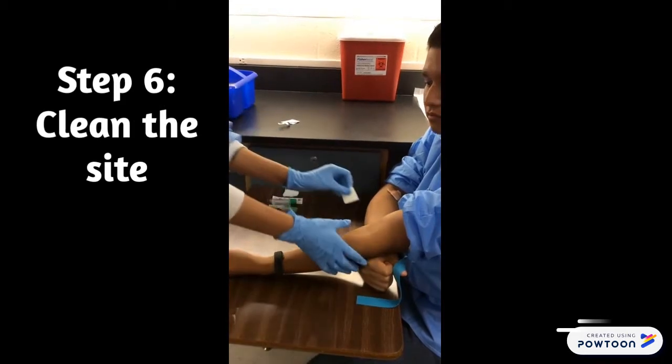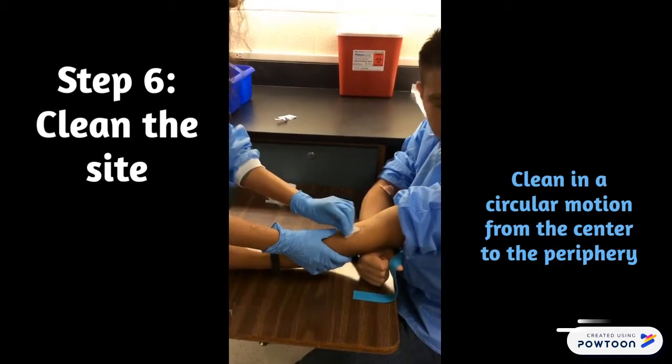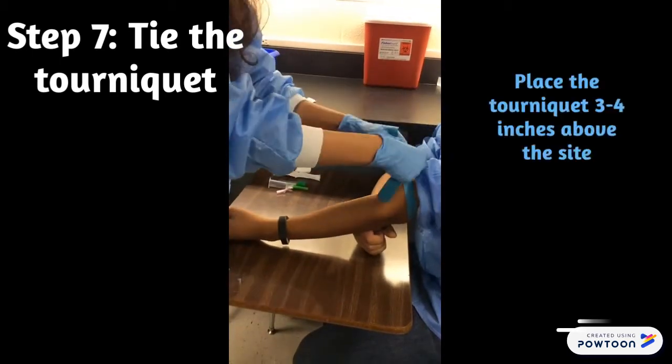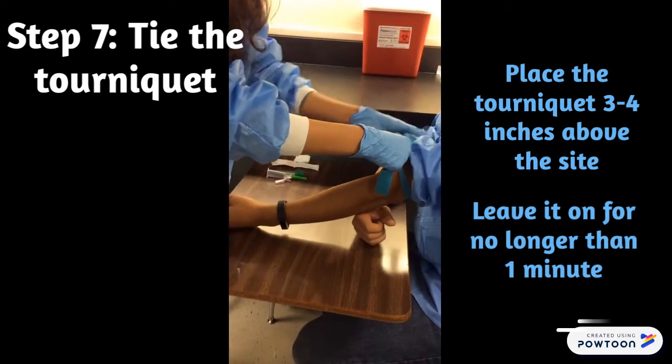The next step is to clean the venipuncture site in a circular motion from the center to the periphery. Then tie the tourniquet. The tourniquet should be placed three to four inches above the site and should be left on for no longer than one minute.